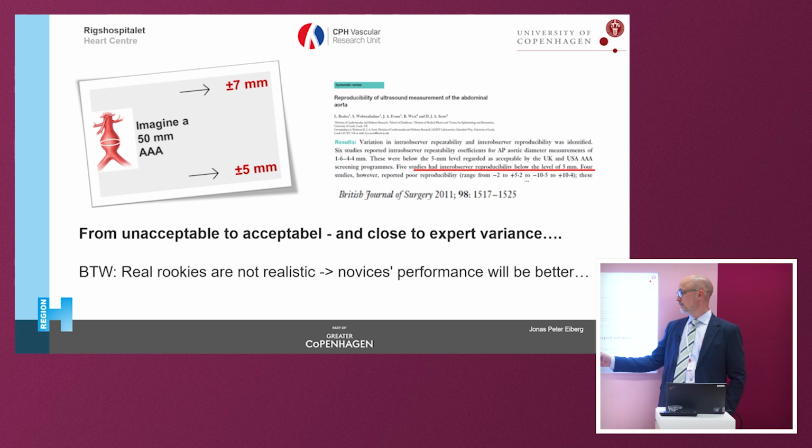And these 5 millimeters, I think it sounds a lot. But remember, these were really rookies. They have no clue about ultrasound. So if you have someone that has some ultrasound experience, you must expect that these 5 millimeters would be even less.